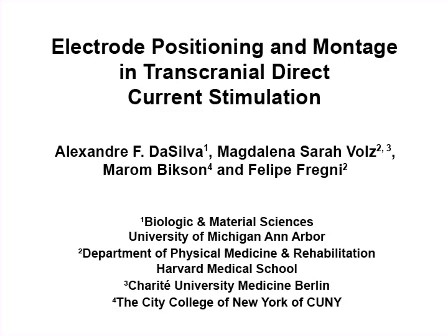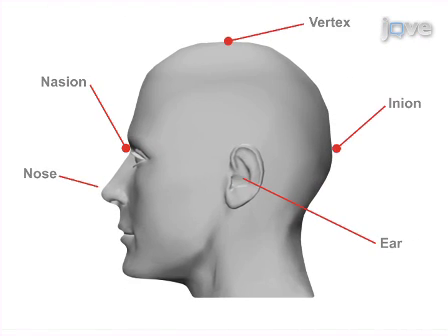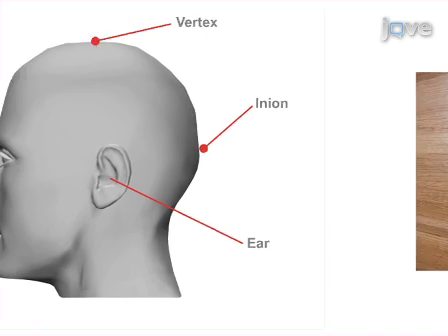The purpose of this video is to demonstrate the technique for administering a session of tDCS, using primary motor cortex stimulation as an example. This is accomplished by first measuring the subject's head and marking the sites of stimulation.